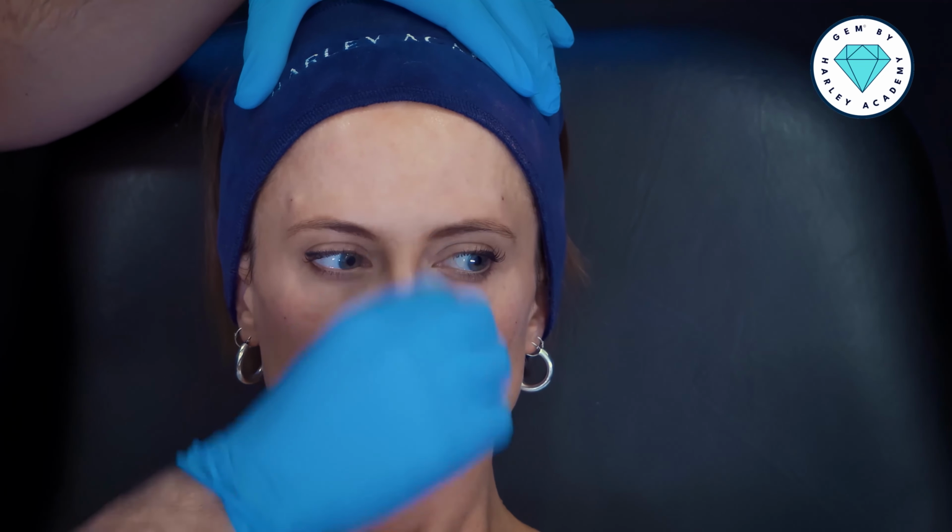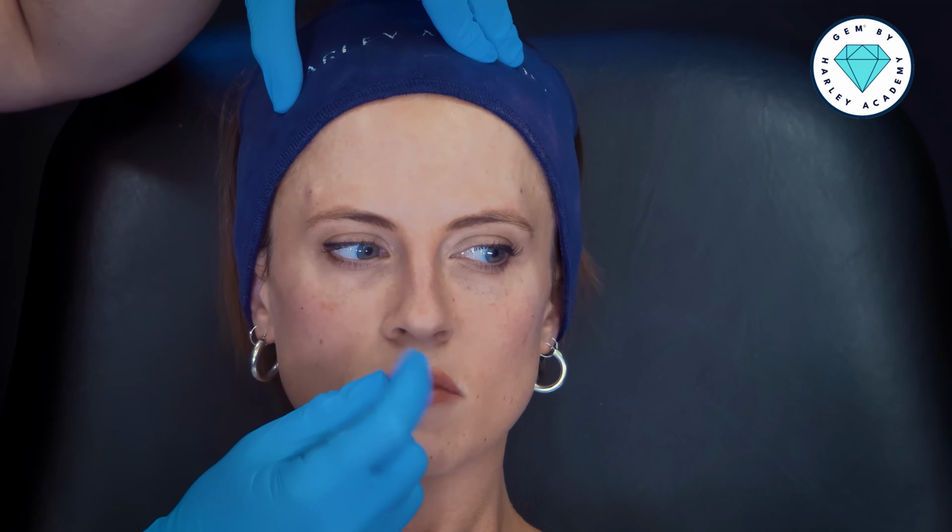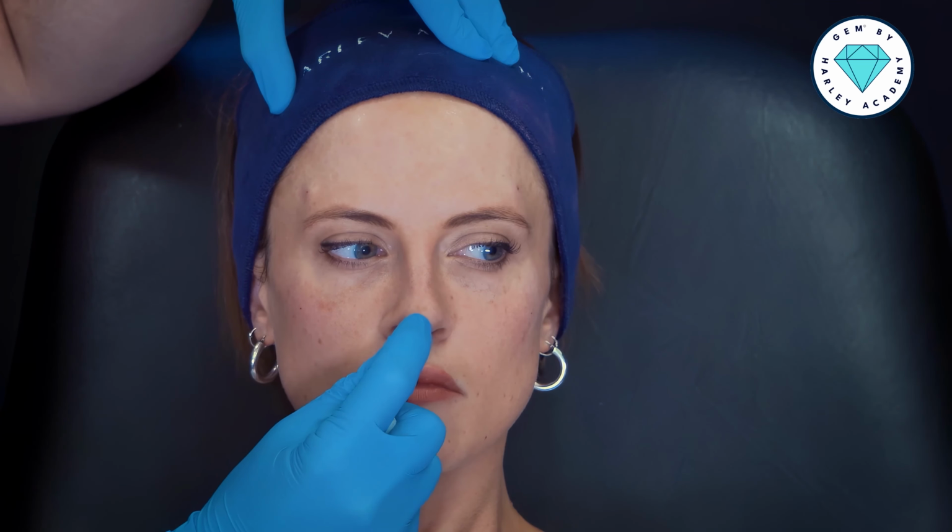Having said that, the nose is always one of the highest risk zones of the face, and so anything we can do to minimize risk in the nose is important. In this case, I'm going to be using a 25 gauge cannula, and I'm going to be making a single entry point in the tip of the nose to try and address the dorsum with a cannula alone. So rest your head back for me.